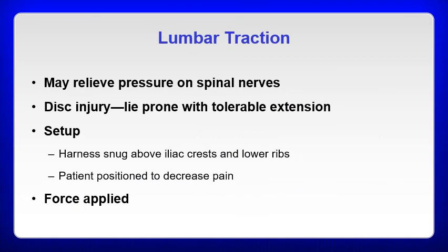So lumbar traction, again, you may relieve pressure on spinal nerves. Again, you'll still get all the other benefits we talked about in relation to the different tissues there. For a disc injury, again, typically you can have them lie prone. That would be your usual position for disc injury.